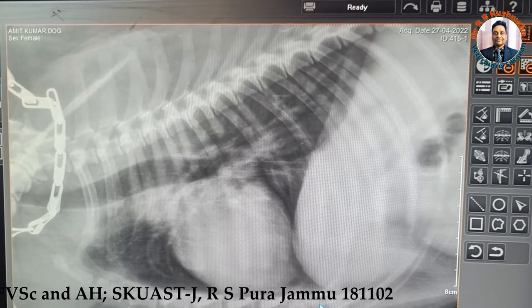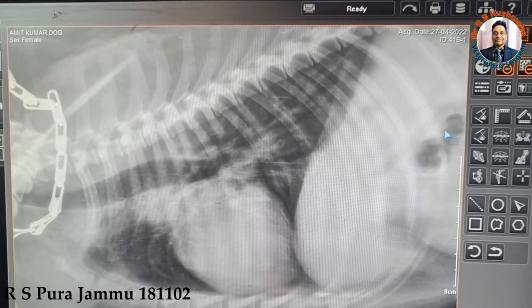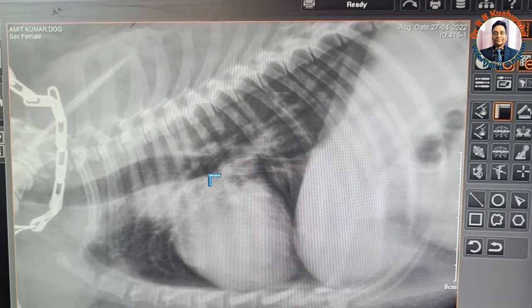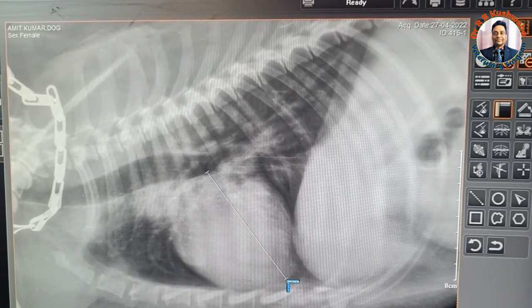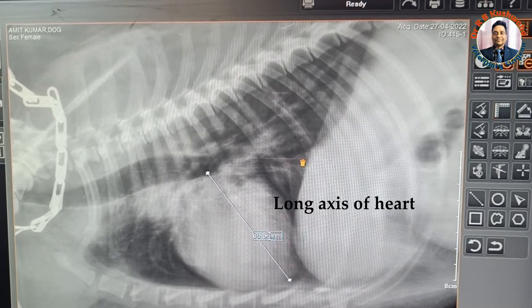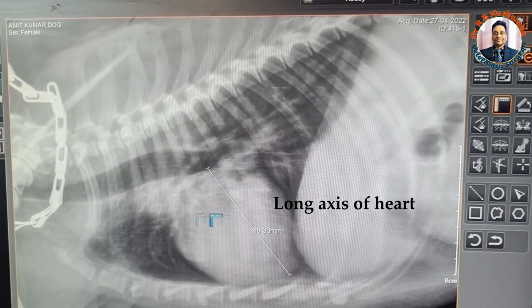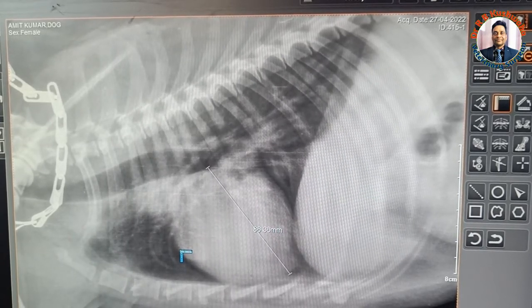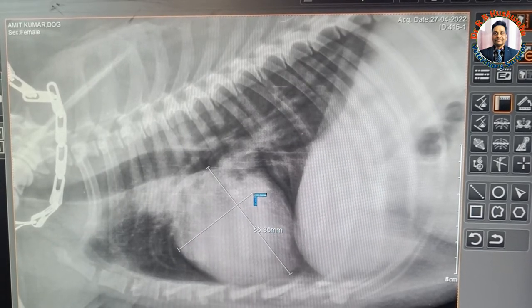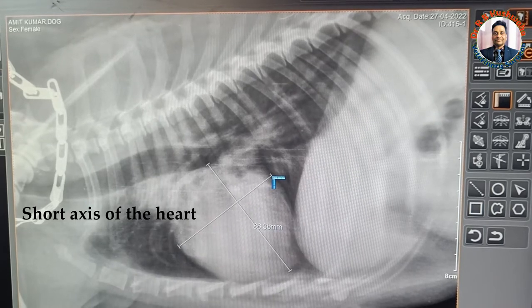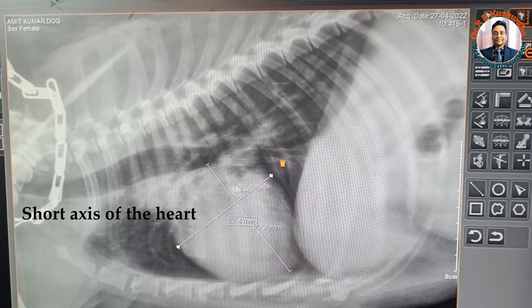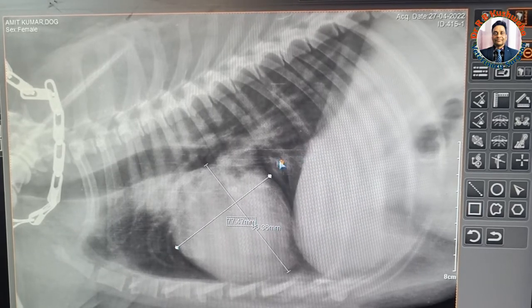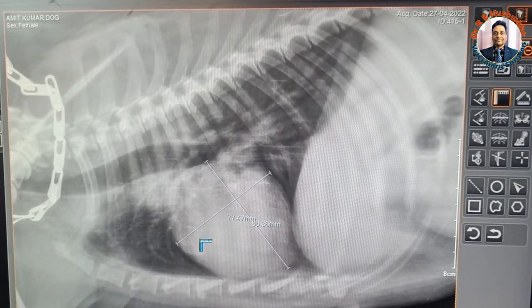To measure the vertebral heart score, first we draw a straight line starting from the ventral margin of the carina — that is the bifurcation of the trachea — up to the apex. This is the long axis of the heart. The second measurement is the short axis: we start from the cranial cardiac border at the maximum width, which should intersect the long axis at a right angle. Normally it lies just below the ventral border of the caudal vena cava.